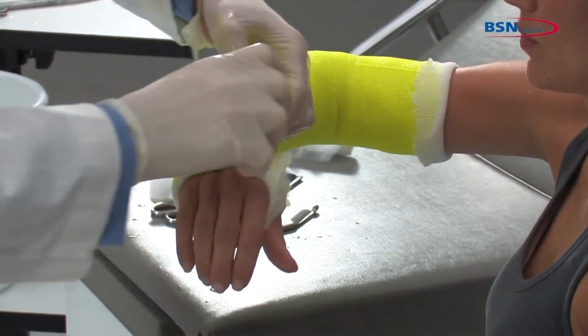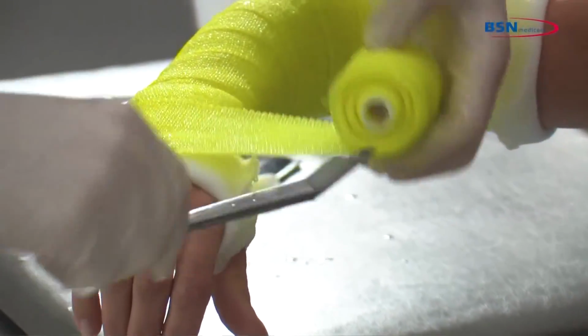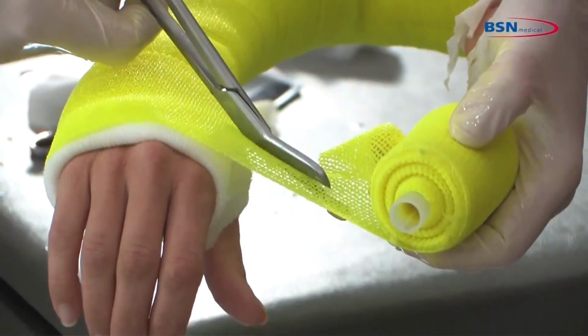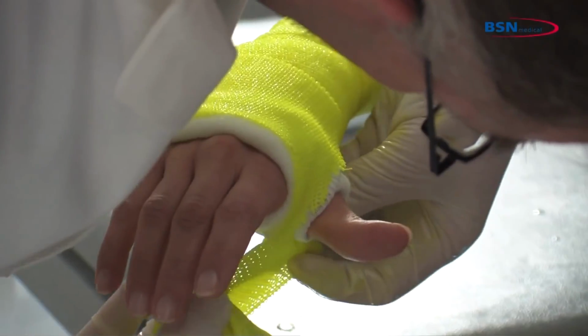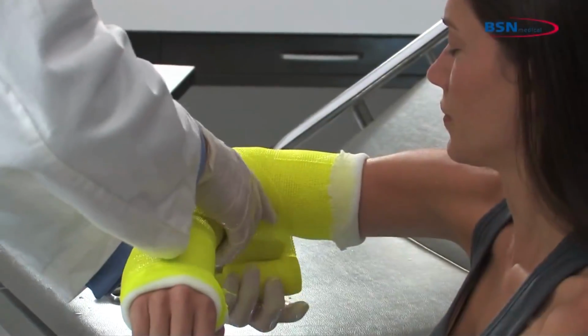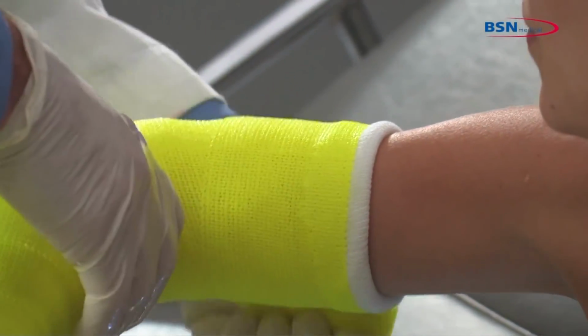Start wrapping the cast at the wrist and go through the web space. Go around the hand and continue with 50% overlap toward the elbow. Avoid placing the edge of the cast tape in the antecubital fossa and continue wrapping toward the upper arm with 50% overlap.